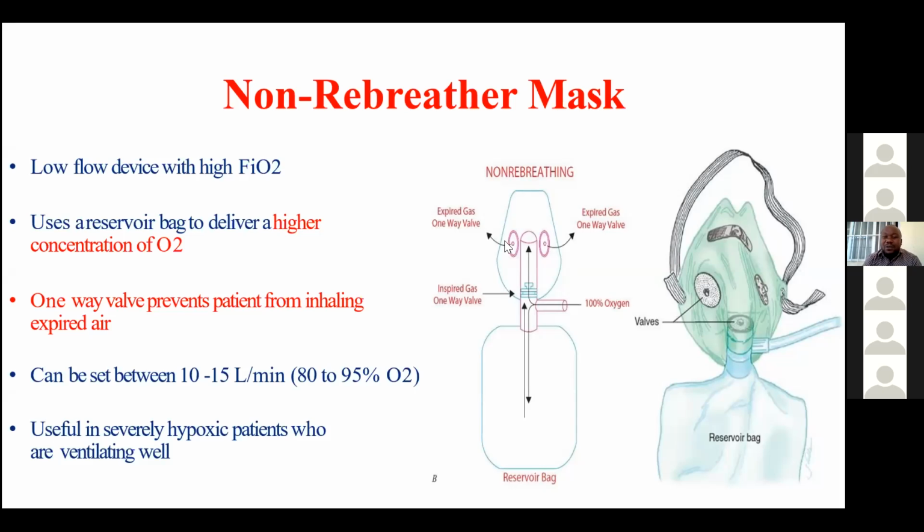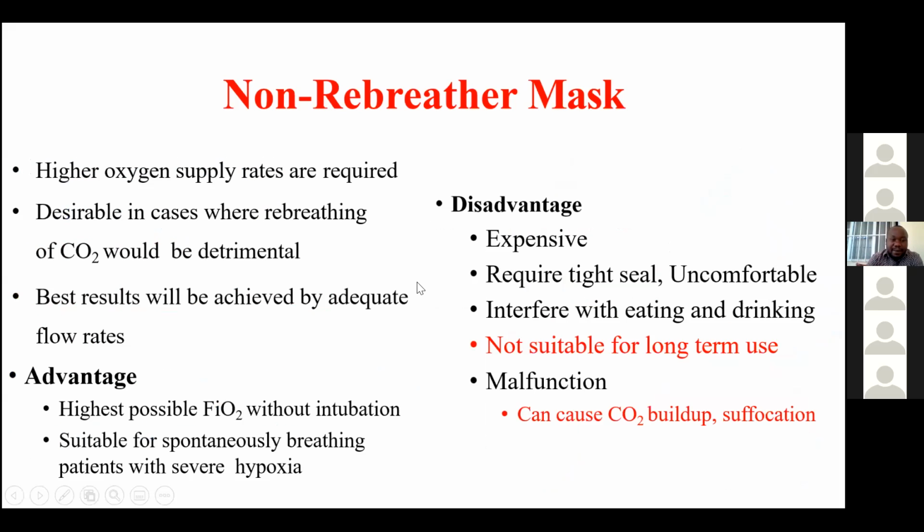So please don't close those expiratory valves, and make sure that the inspiratory valve in the non-rebreather with the reservoir is functional. Some of them are not, and they make your patients uncomfortable rather than helping. So the message here is to know the physiology of this non-rebreather mask and the importance of these valves in it. Next, please.